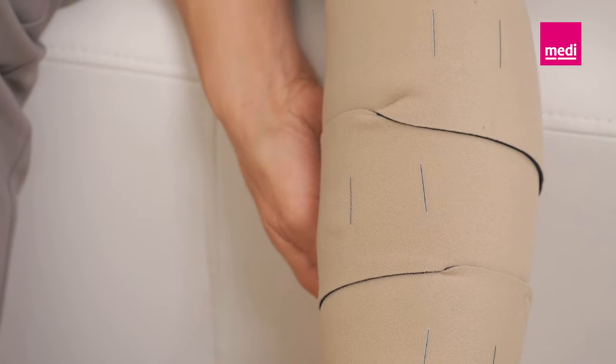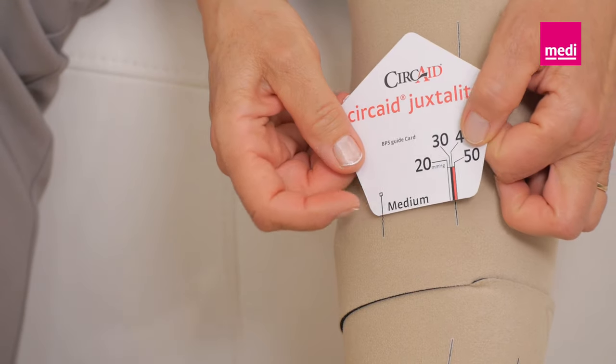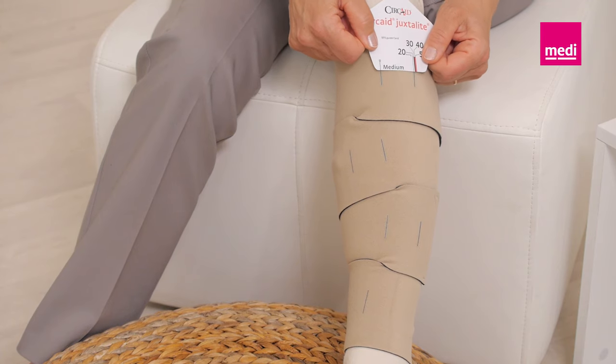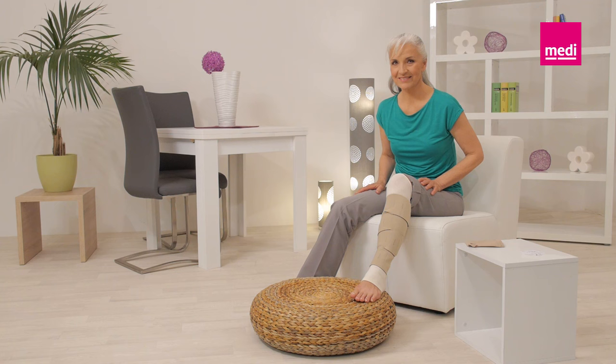If less compression is needed, completely loosen the band and refasten it with less tension. Repeat this process with each band going up the leg. Make sure to adjust each band to the same level of compression. Readjust the bands as needed throughout the day to provide firm and comfortable compression.